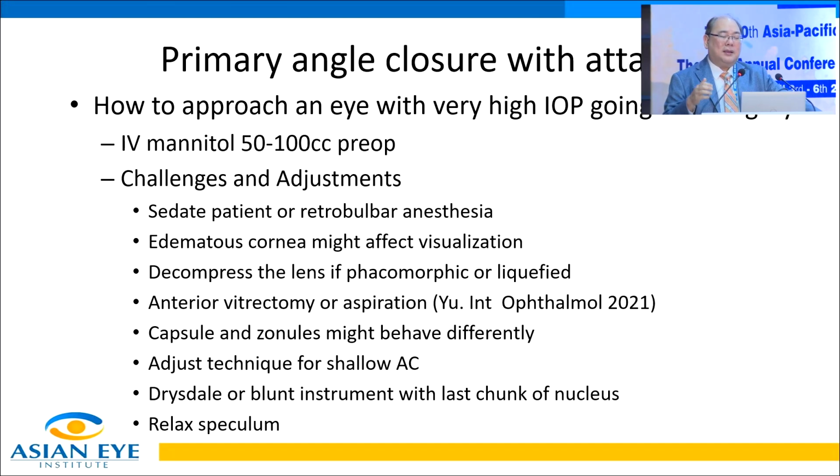Now, one thing about the angle closure, sometimes they have a weird feel when you do a capsulotomy. I don't know if you feel that they don't tear as, they're not as robust in tearing, so they can extend out. And I've had several cases where the zonules were affected by the very high pressure. So we have to be very careful with this. I usually tap a little bit in the slit lamp to see if the lens is moving. But during phaco, sometimes you groove and you're pushing and then the lens is moving. So you kind of want to be careful.